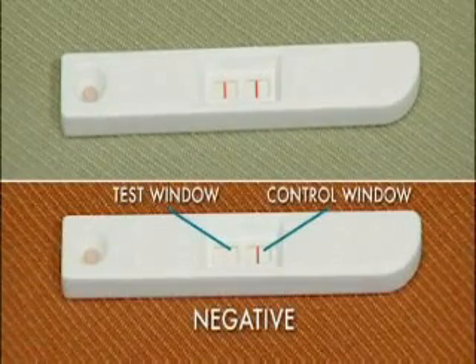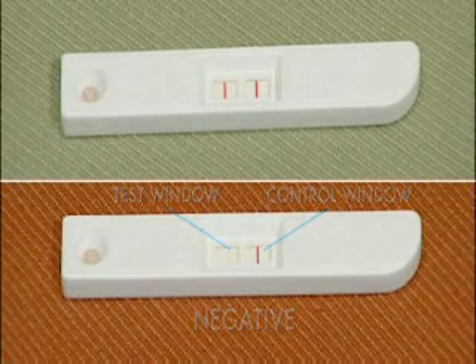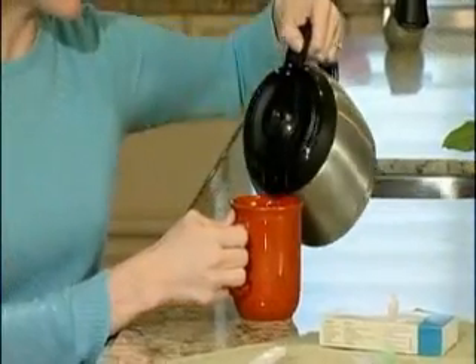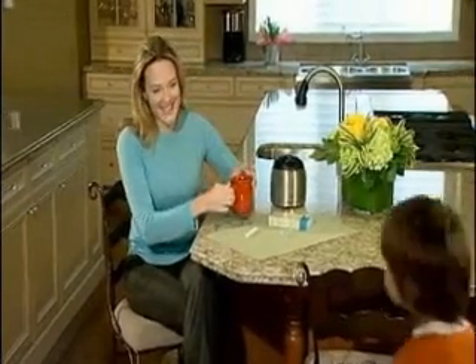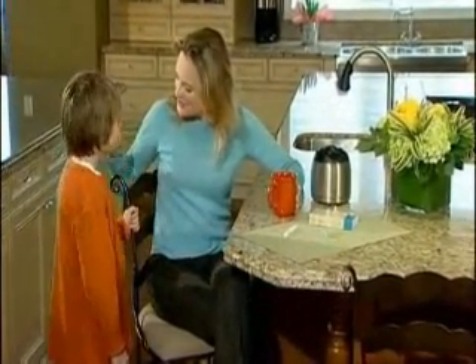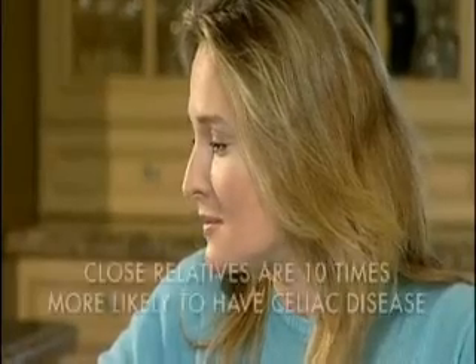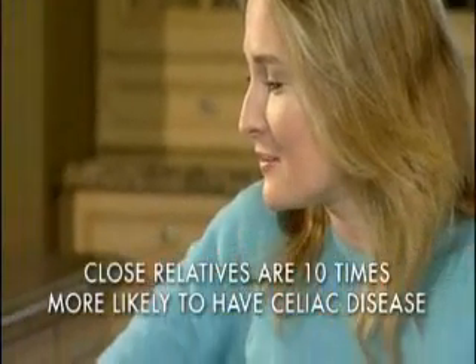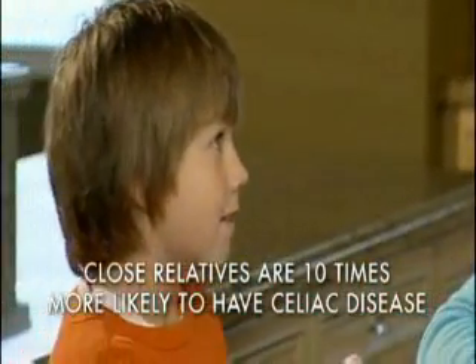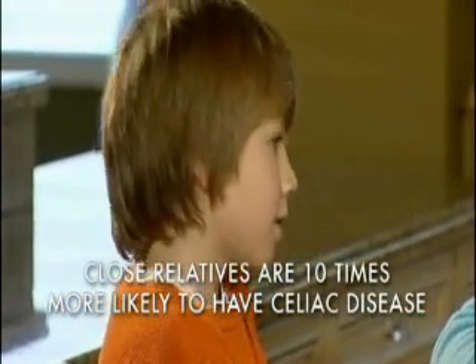The BioCard test result is negative for celiac disease if there is no red line in the test window. If you do test positive for celiac disease, see your doctor and continue with the normal diet under their supervision until you have the diagnosis confirmed. The good news is, more than 70% of people with celiac disease respond to a gluten-free diet within days or weeks. And remember, if you have tested positive for celiac disease, early screening with the BioCard Celiac Test for your children, siblings, and parents is important, as their risk factor for celiac disease is 1 in 10.